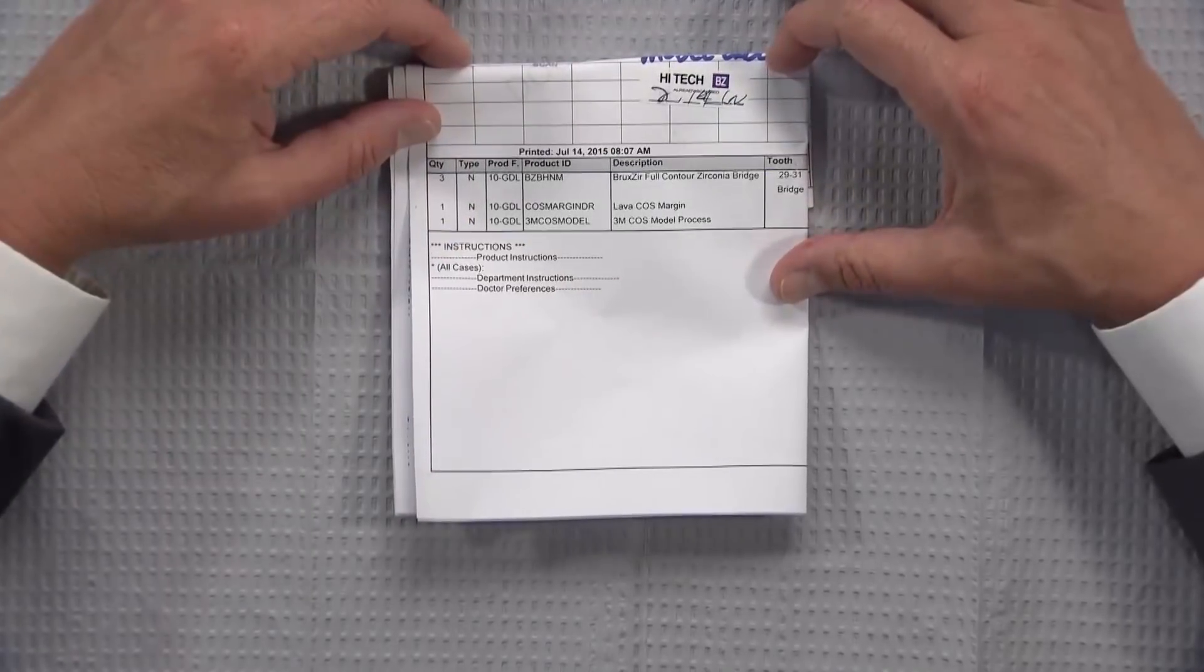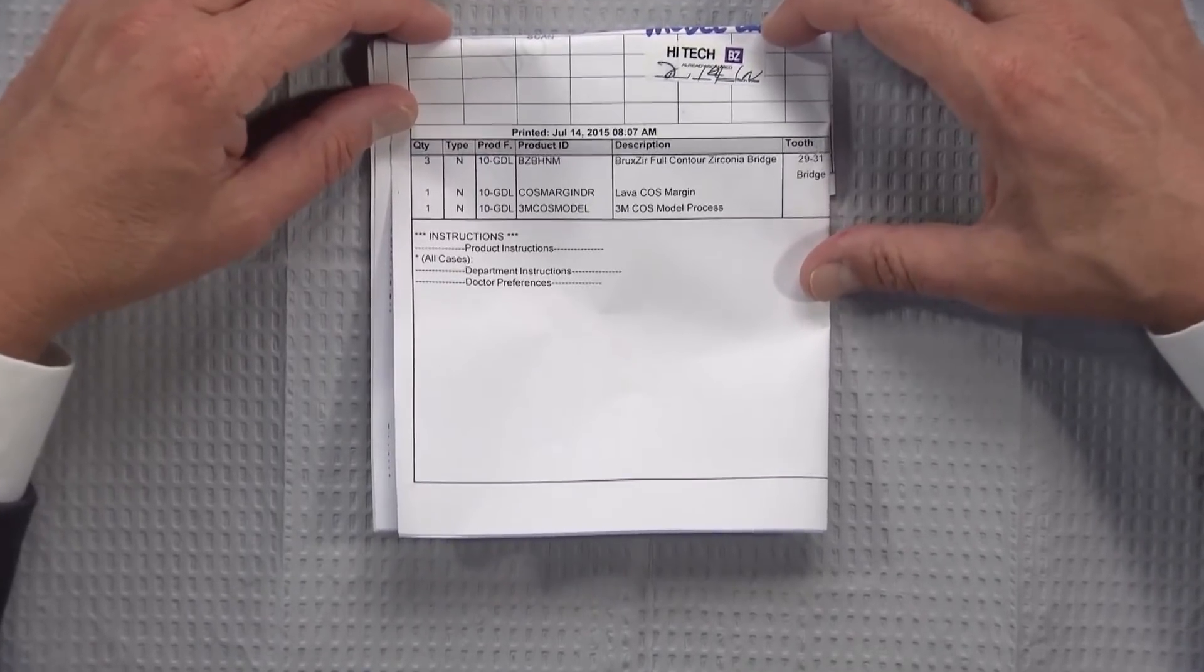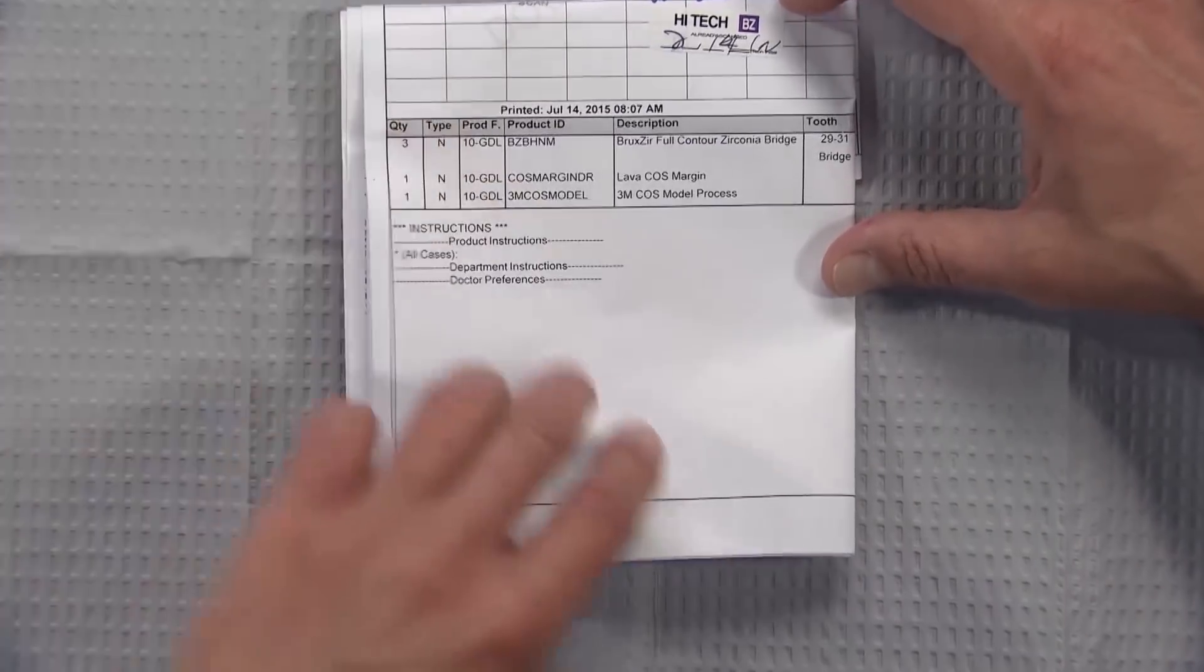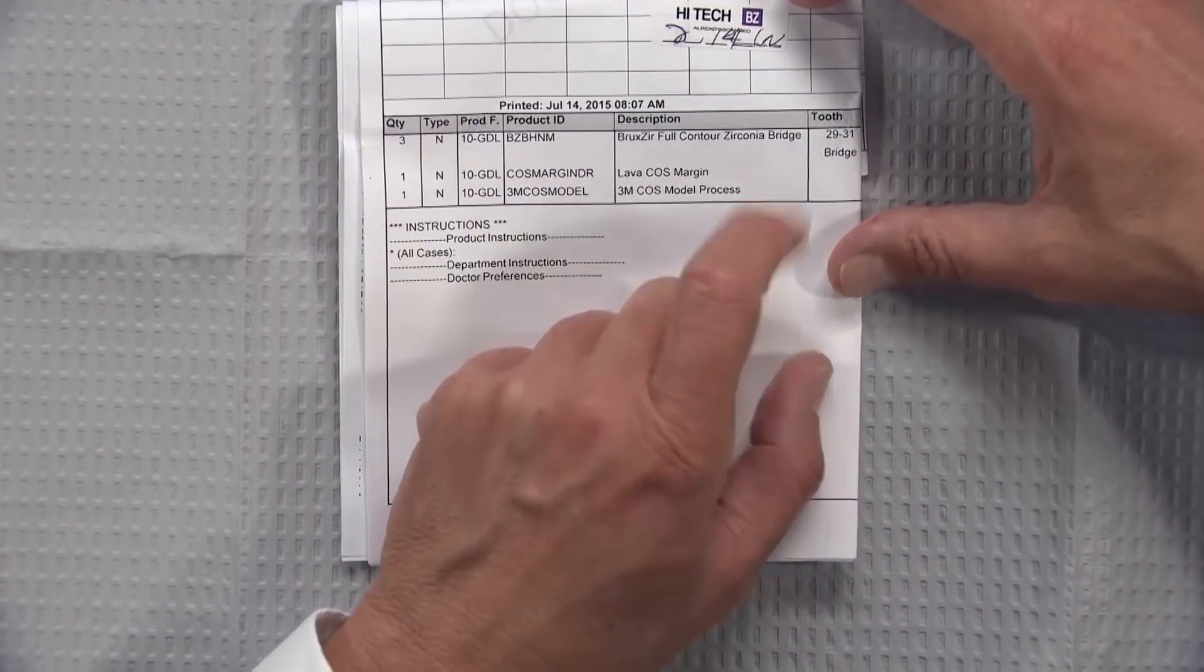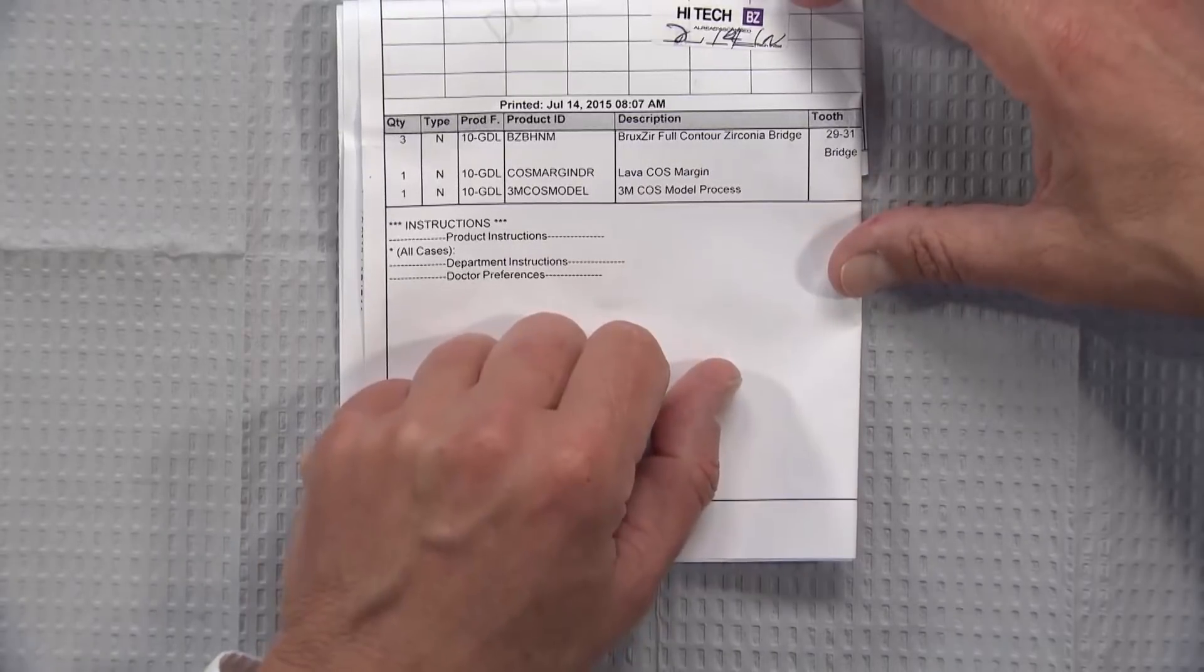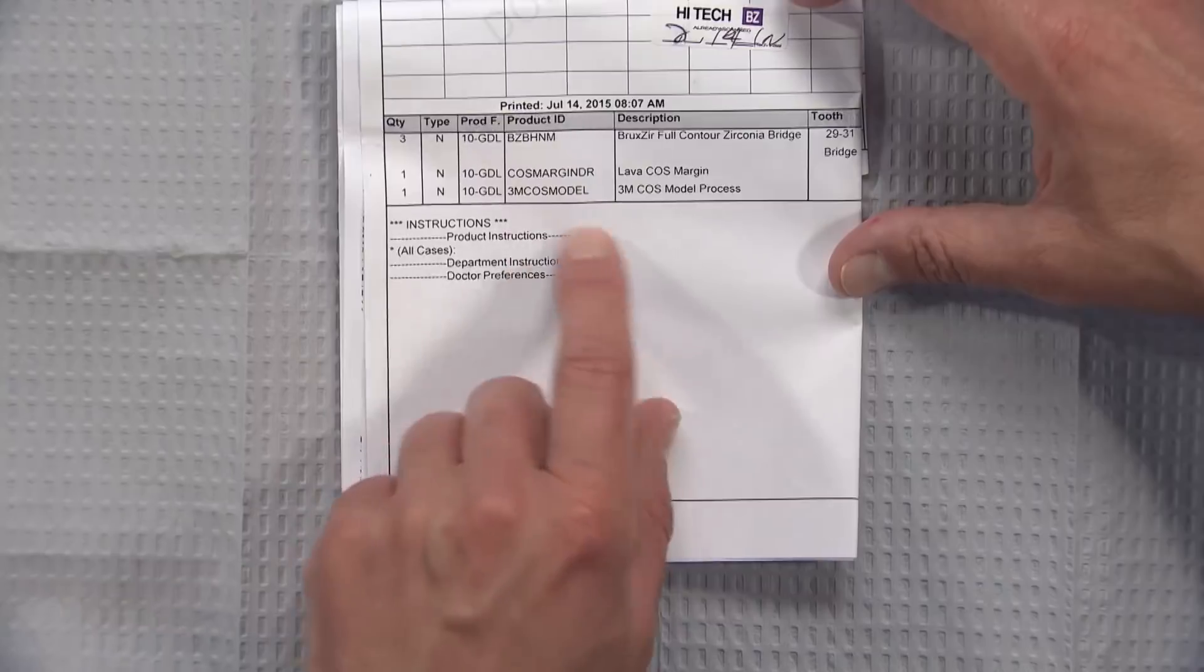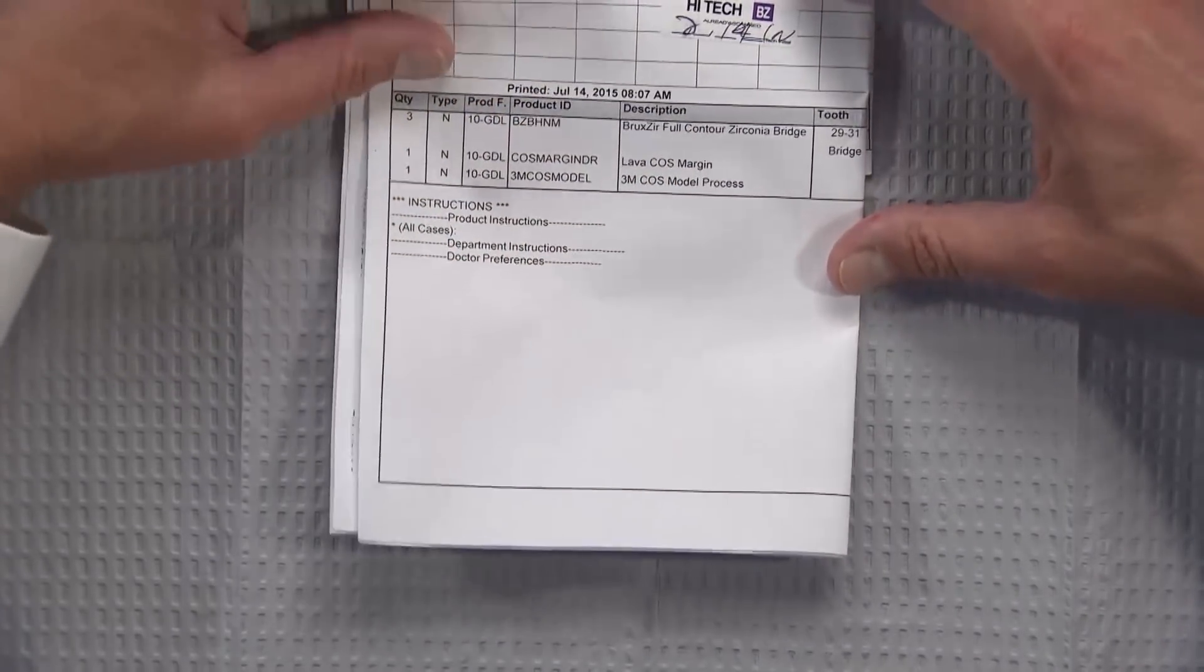Today's case is a doctor who has taken a digital impression with his Lava COS scanner and would like a Bruxer solid full contour zirconia bridge from teeth number 29 to 31. The doctor has the option to request the bridge in the software itself and has requested a model for that, which we obviously want when we're making a bridge, a little different than a single unit where we still like to have a model to be able to work with.